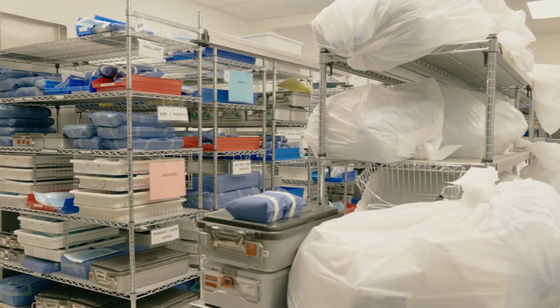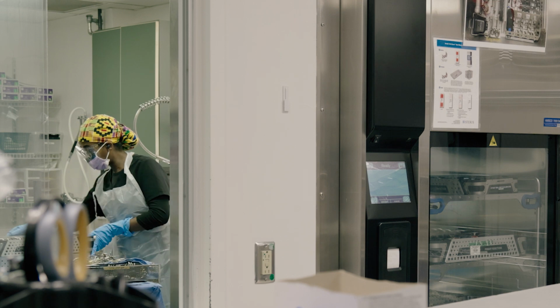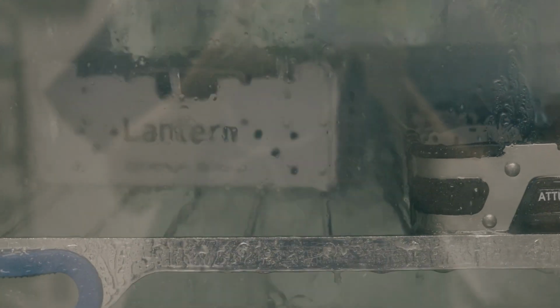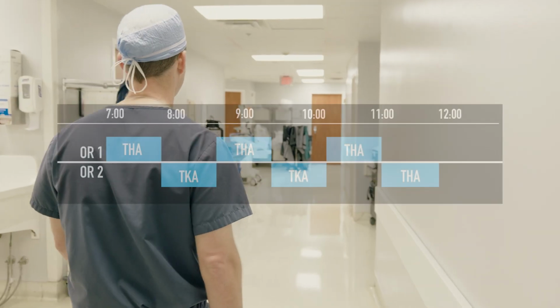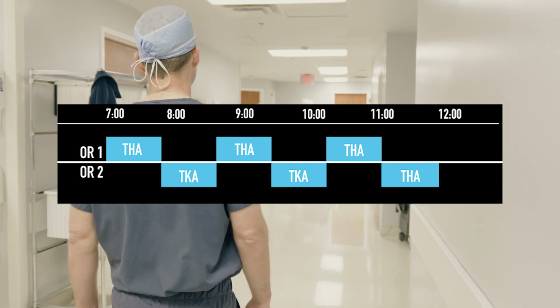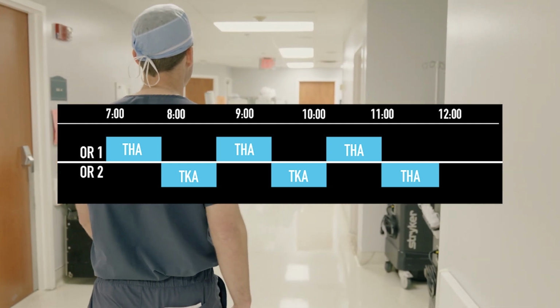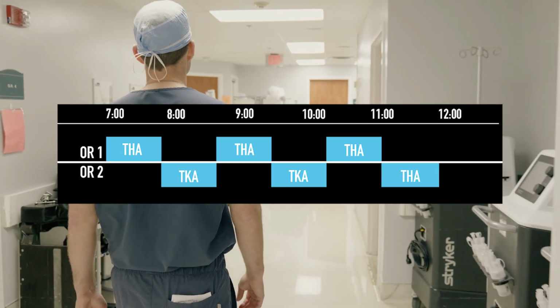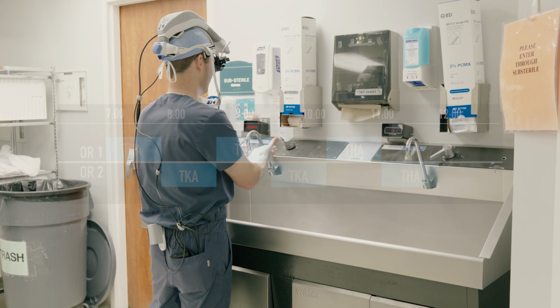Compared to a large hospital OR setting, the surgery center sterile processing room is significantly smaller, which encourages us to become more creative with processing of multiple trays. So we're planning on performing 4 primary hips and 2 primary knee replacements today with 2 rooms. We're going to be flipping back and forth, trying to be as efficient as we can. We're starting at 7 a.m. today and planning on being finished by noon.